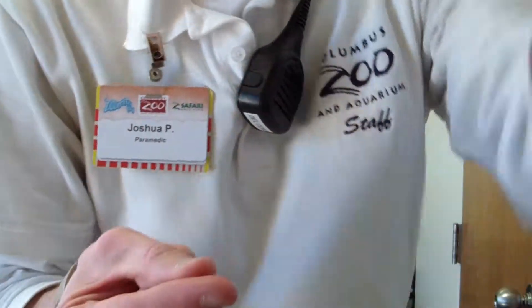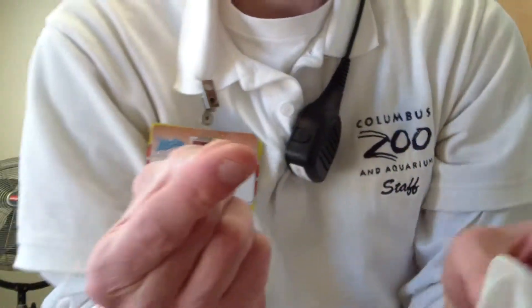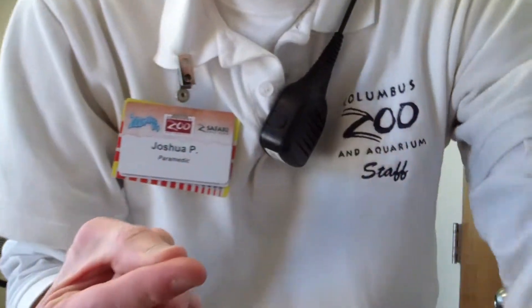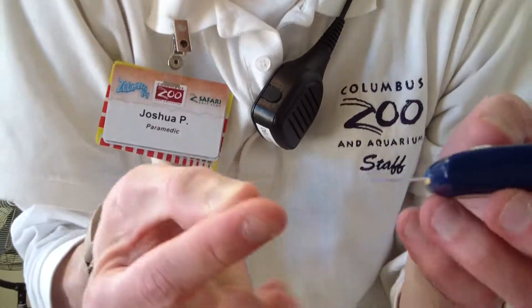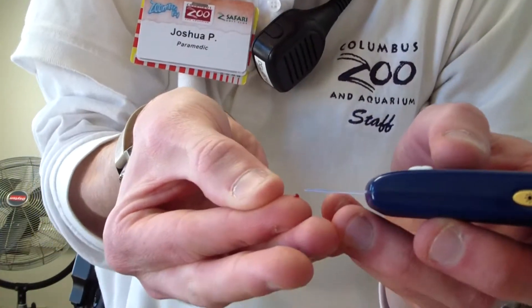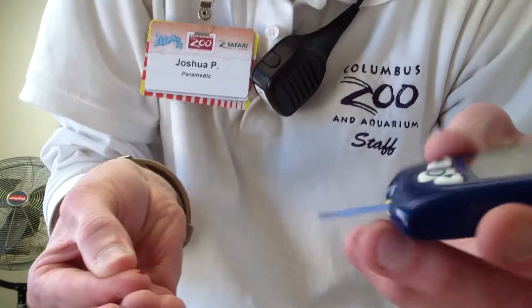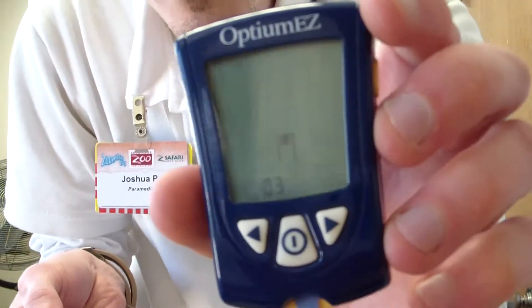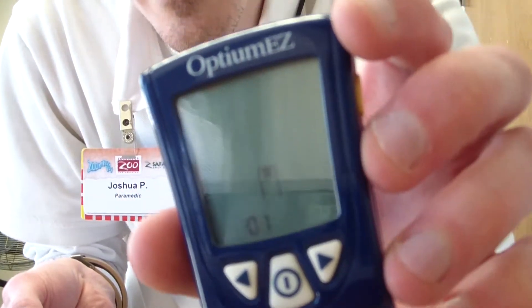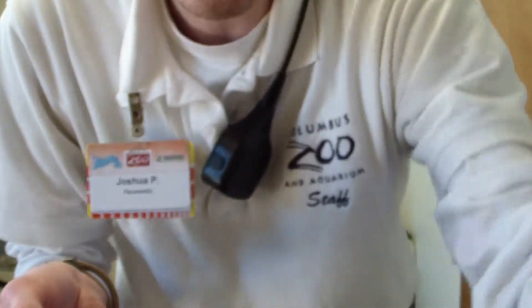Ow. So blood is on my finger now. What we're going to do is wipe the first layer of blood off, and try to get the blood into the glucometer. It's thinking about it, and I'm at 93. I haven't had lunch yet, but that's still pretty good.